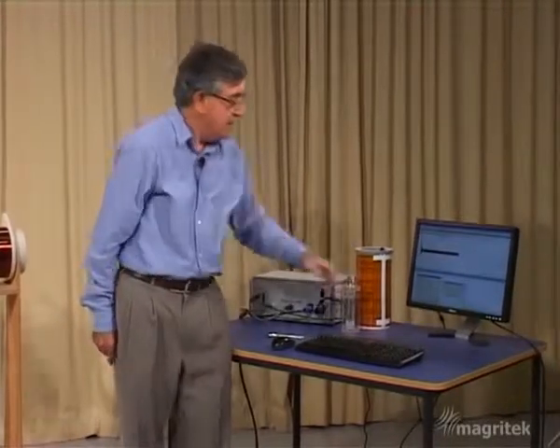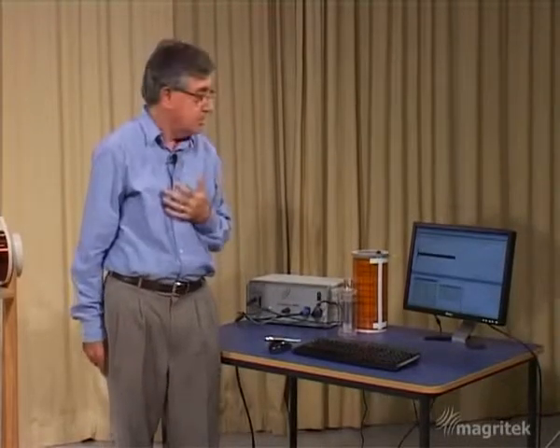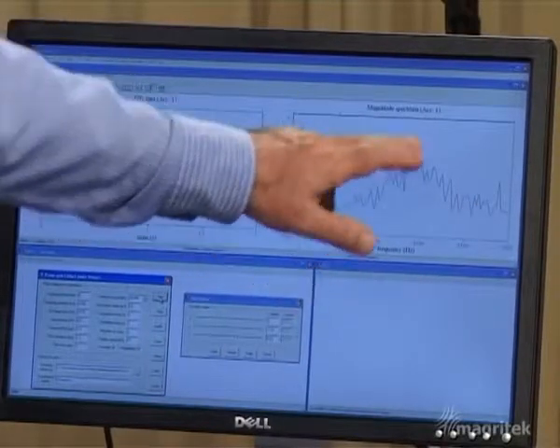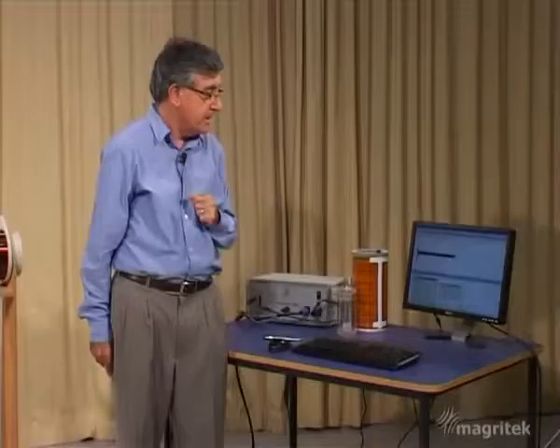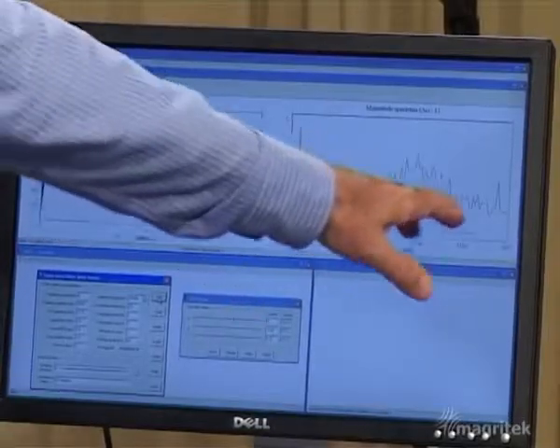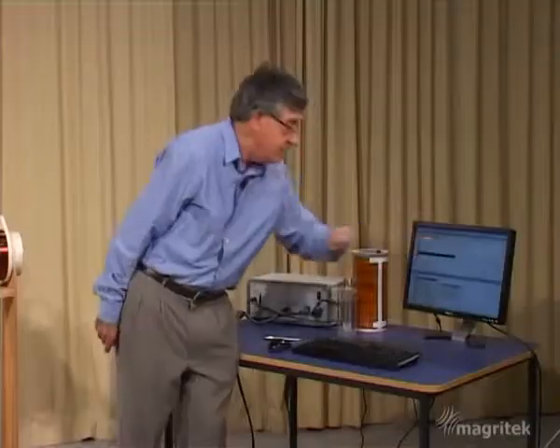Now the area under that spectrum is exactly the same. It's related to how many atomic nuclei we've got in our sample. So if the spectrum is made broader, it means that the height of the spectrum is going to be much smaller to conserve the same area. And that lowering of the height of the spectrum makes the noise much more visible. So we have a much noisier looking spectrum than we had before.